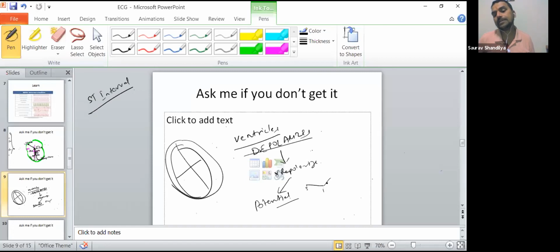Before the T wave starts, you have a ST interval. That is the key reason it is keeping silent, just like your PR interval, right? The ST segment is mostly it shows with the isoelectric line, which is actually okay. Anyway, we'll talk about the leads little later. It is actually normal in the V1 kind of thing, or like normally elevated also. That we'll talk little later. So ST segment is very, very important when we have to choose the pathology.